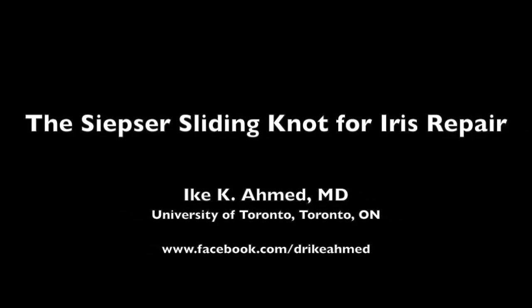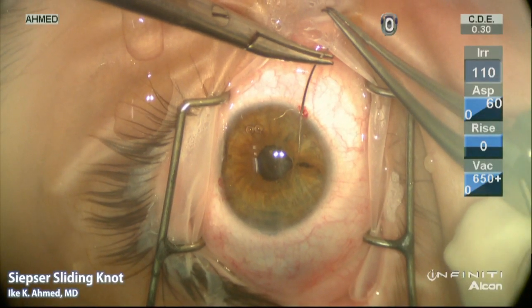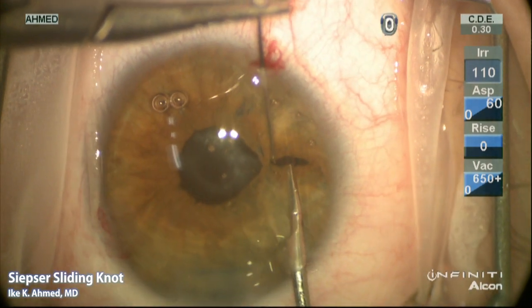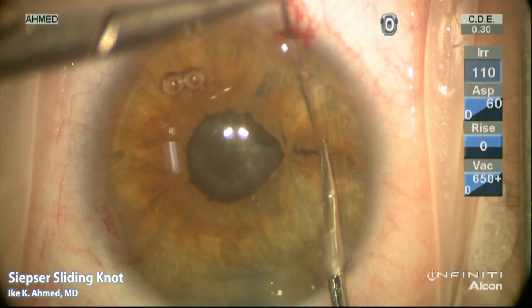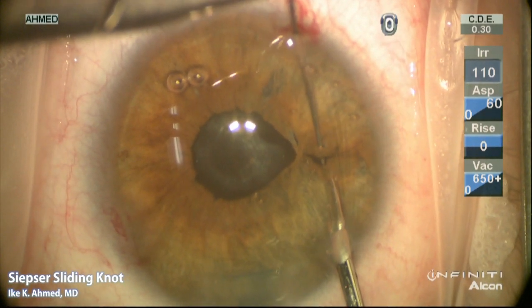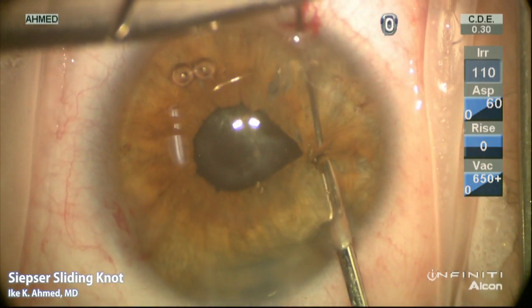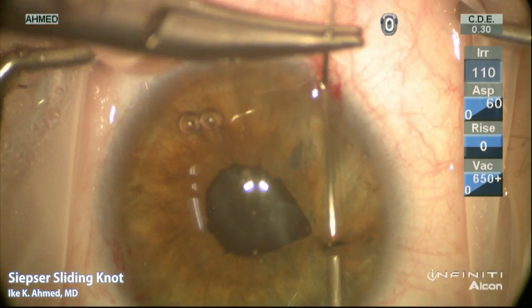This video describes the Siepser sliding knot technique for iris repairs. We are using a 10-0 prolene on a curved CIF-4 needle. A micrograsper is used to hold one leaflet of the iris defect while the needle is passed through the iris and emerging through the other leaflet to create a pass between both sides of the iris defect.